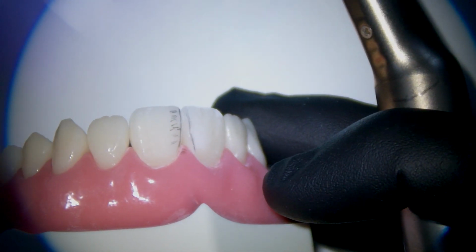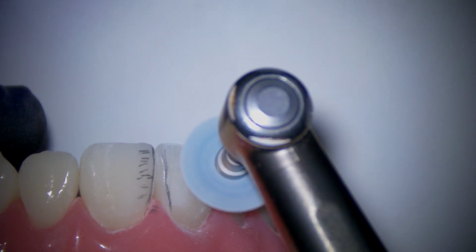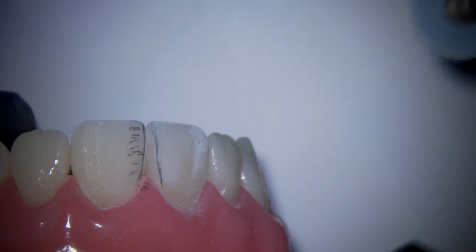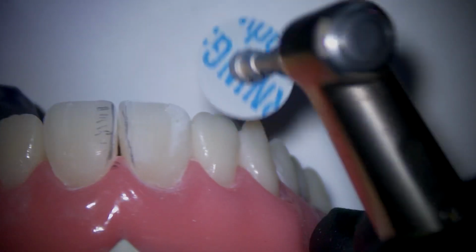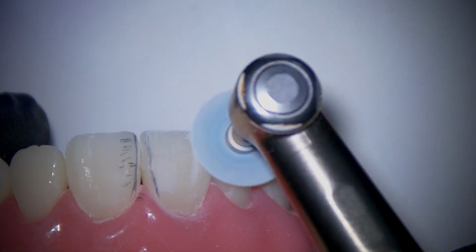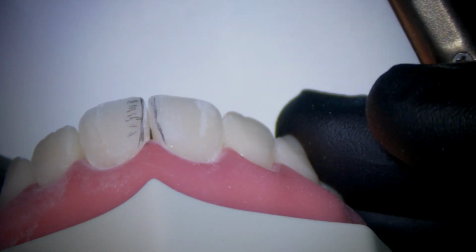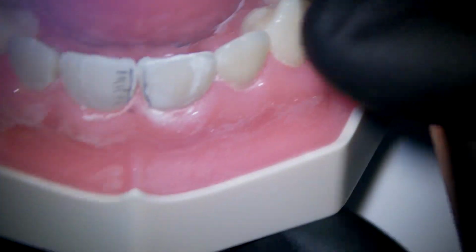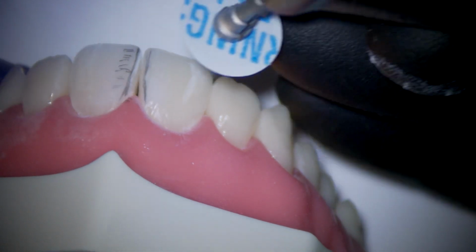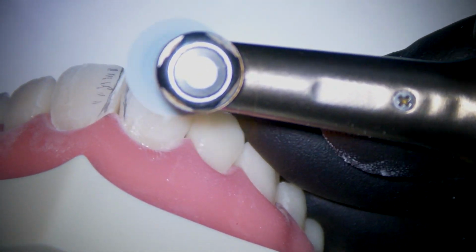I'm going to zoom in a little bit. You'll notice as I'm working my disc, I'm not lifting the disc off the tooth surface. I'm rotating it around. See this little spot right here. And that's how we blend that composite onto the facial surface to make a seamless margin.